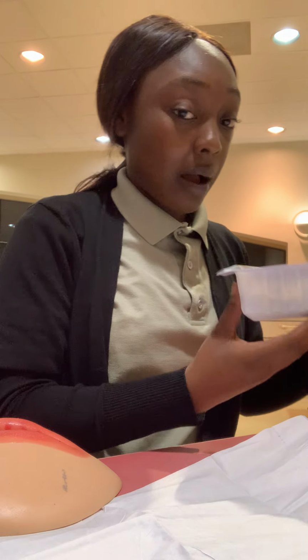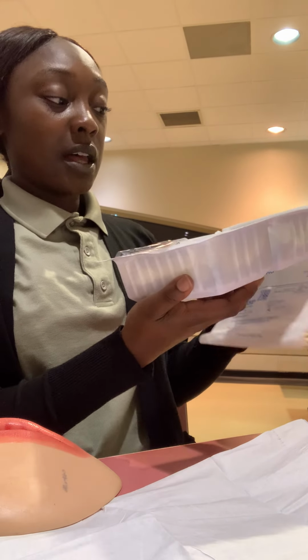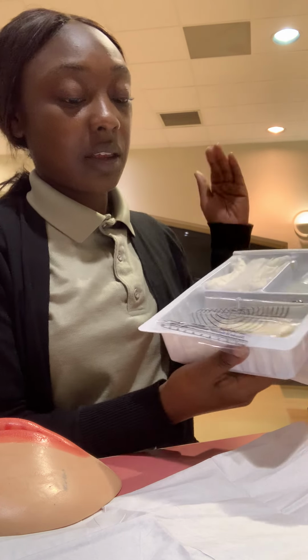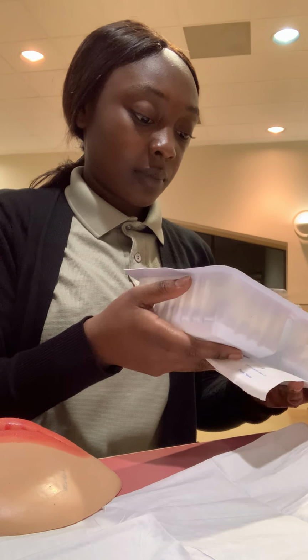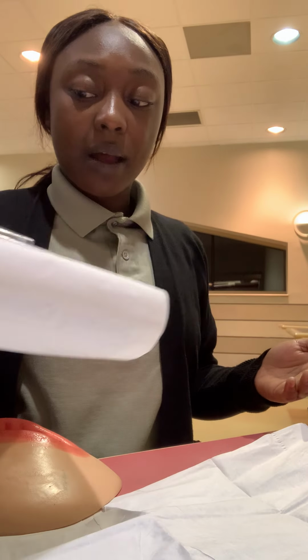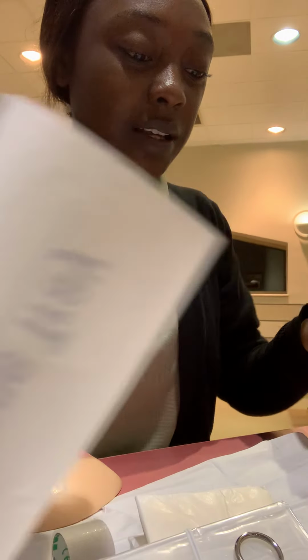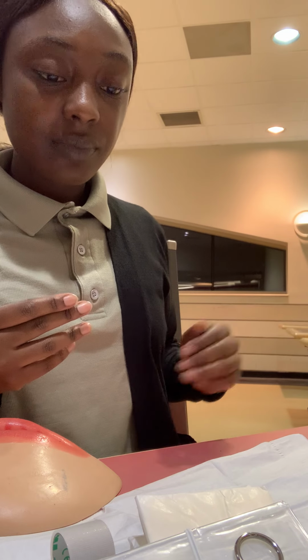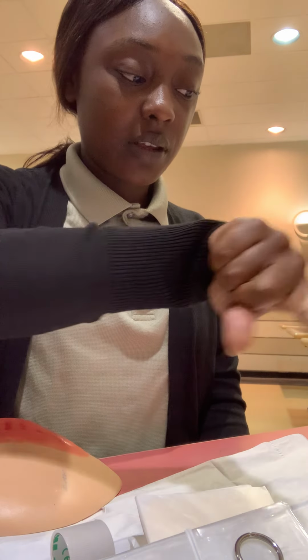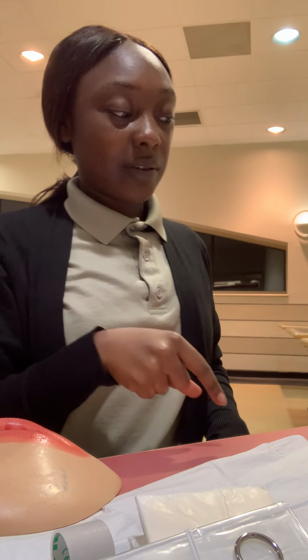So next I'm going to take my box from the bottom part. Ensure that the flap does not touch anything because it is unsterile. Now I am going to flip my box over. Okay, so I have everything in my field.